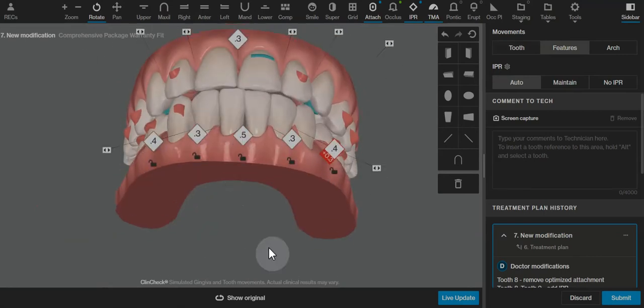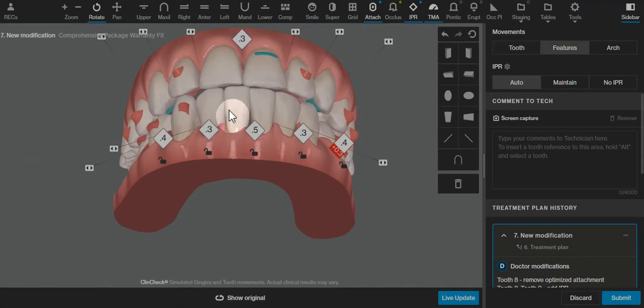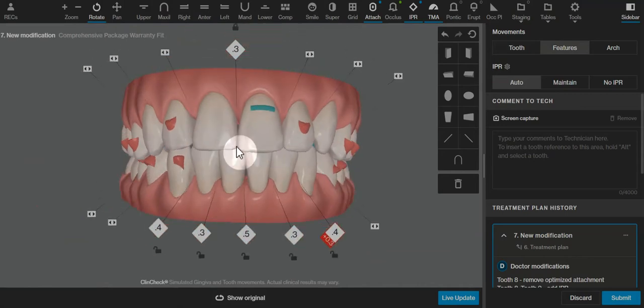That leaves enough sufficient overjet that we're not going to run into an anterior interference, doesn't take off hardly any significant enamel, and can get an overall nice finished look to the case. So I can just click live update, I'll get the next ClinCheck back, and then it'll be ready to approve.